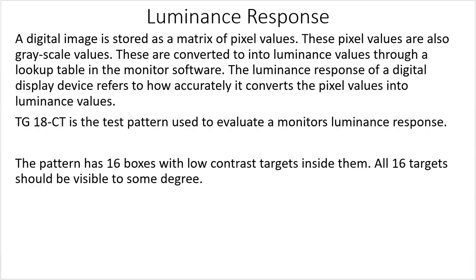Okay, so luminance response. A digital image is stored as a matrix of pixel values. These pixel values are also grayscale values. These are converted into luminance values through a lookup table in the monitor software. The luminance response of a digital display device refers to how accurately it converts the pixel values into luminance values.